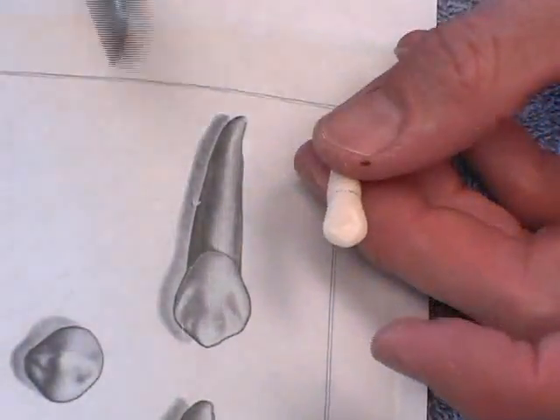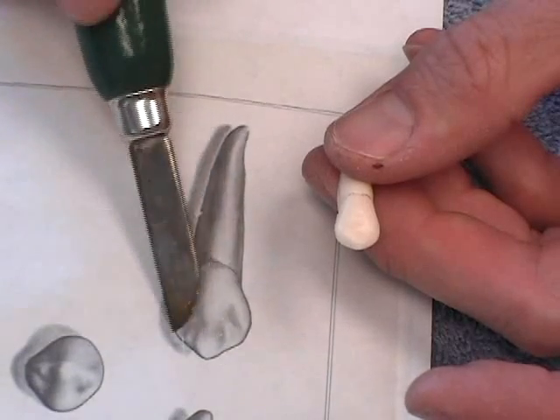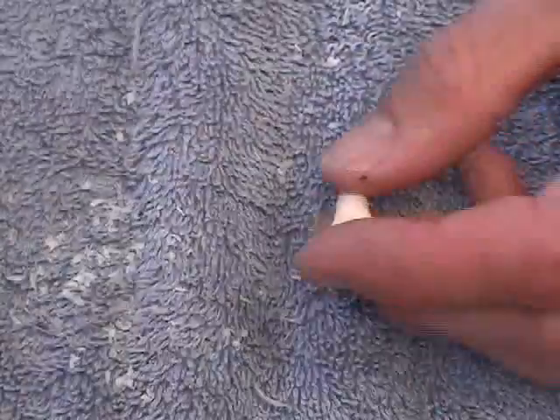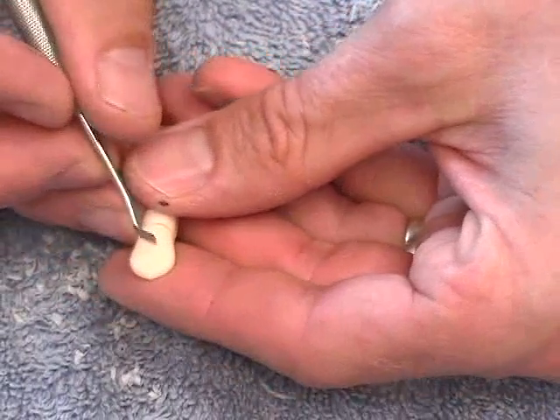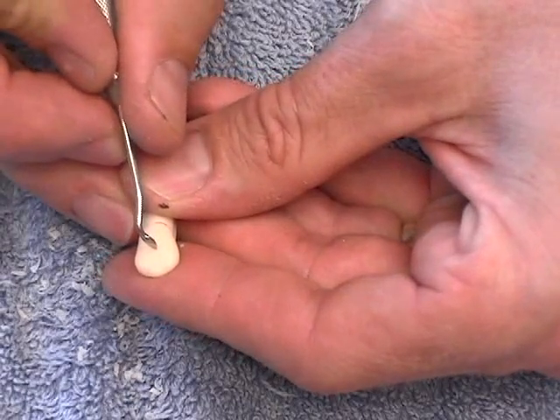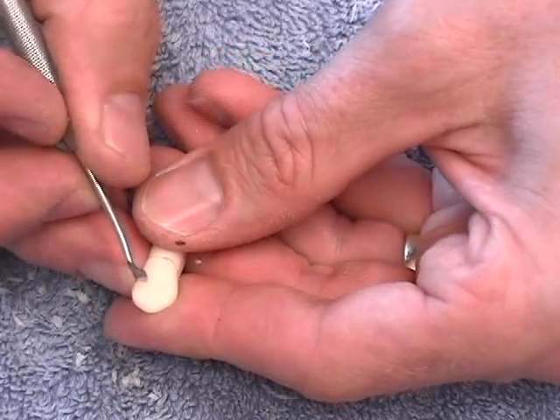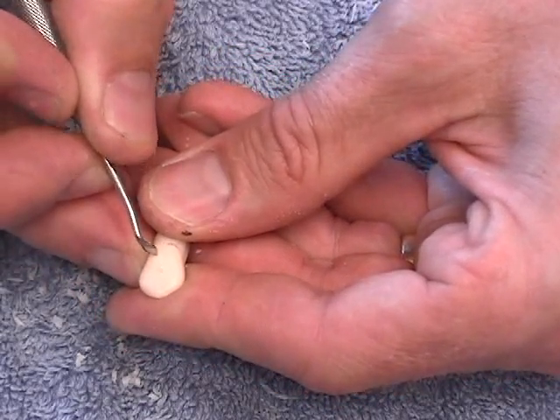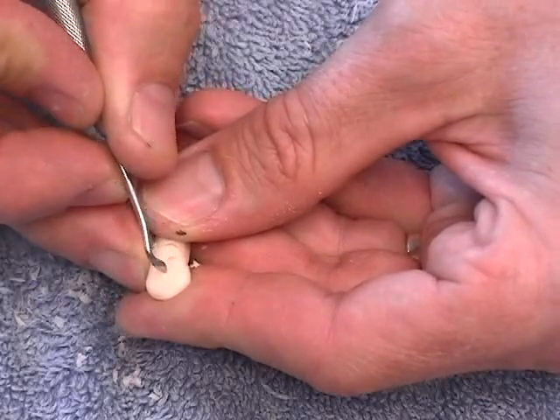The last anatomy we're going to place is the lingual anatomy. To me, the lingual anatomy of this tooth looks sort of like a scoop out, scoop out, and a scoop out — it's almost like a letter W, with three little areas scooped out and maybe a small fourth one. I'm going to go back to a Cleoid Discoid or a Hollenbeck and cut that W into the tooth.